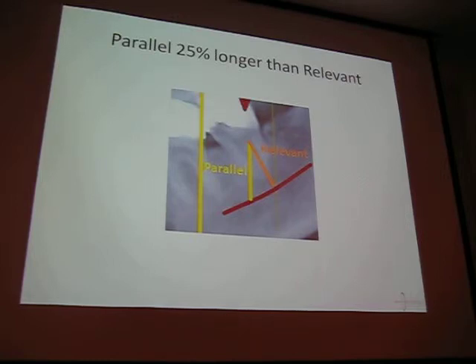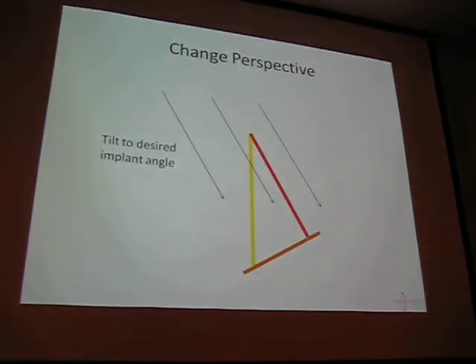So what's the solution? And by the way, just to totally give credit where it's due, for the first year and a half of Reveal, I didn't have a solution. I actually was looking for one. We were trying to triangulate, basically advanced geometry, saying, well, here's what it really should be, because in our software we can't angle the whole thing. We got our CareStream and we could. You can change it at each implant site. You can tilt your software to figure it out.